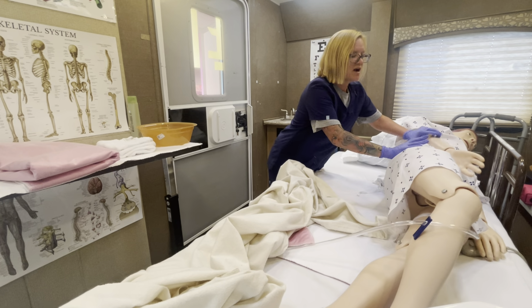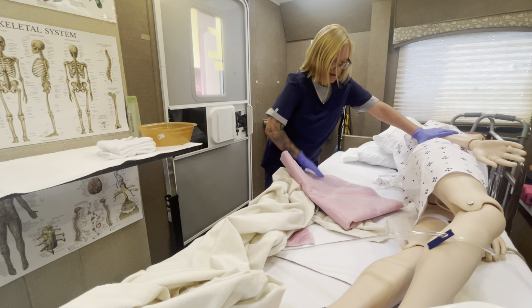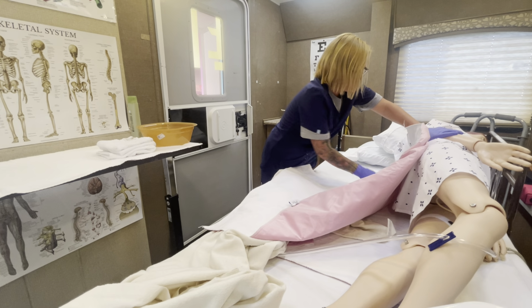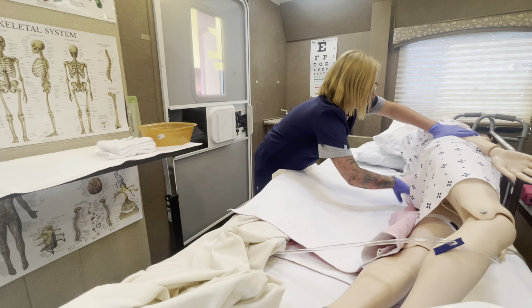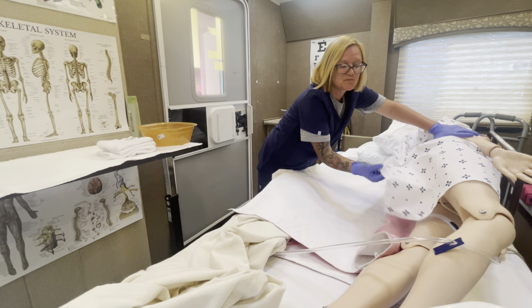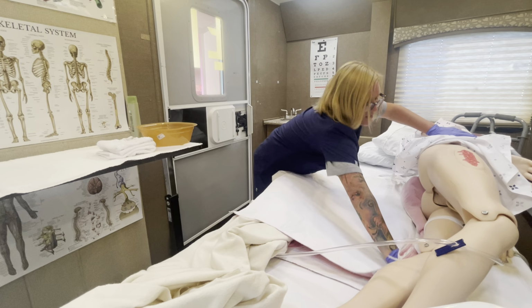Then I'm going to grab my pad. I'm going to open the pad up. I'm going to make sure that it is above the buttocks and covering underneath the peri area. If you roll it, it'll make it easy to go ahead and get it from the other side. Then I'm going to expose him just to show you. I'm going to tuck it underneath of the patient.